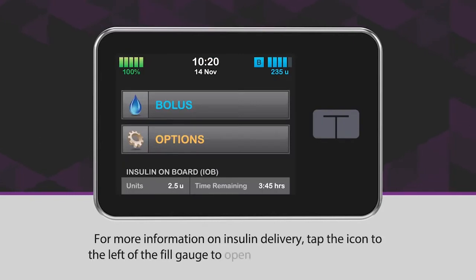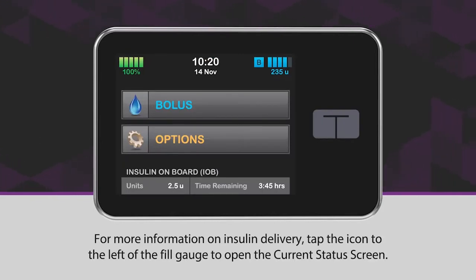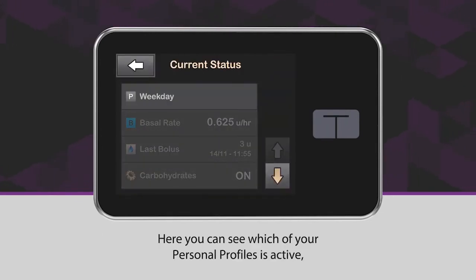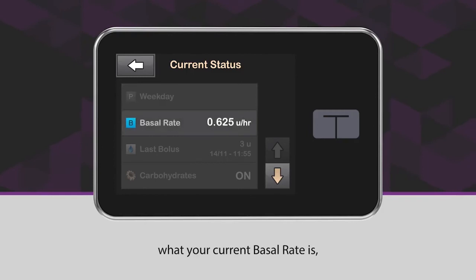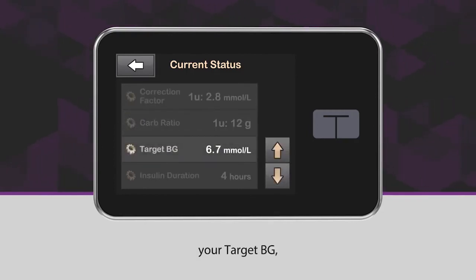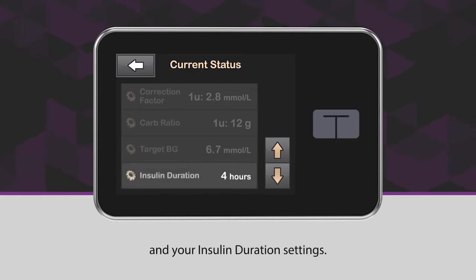For more information on insulin delivery, tap the icon to the left of the fill gauge to open the current status screen. Here you can see which of your personal profiles is active, what your current basal rate is, the time and amount of your last bolus, your target BG, and your insulin duration settings.